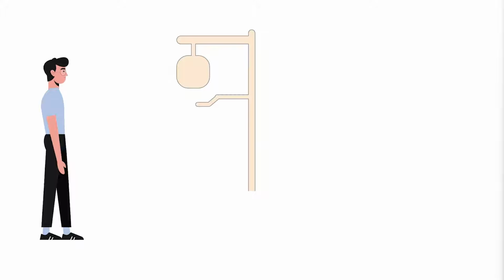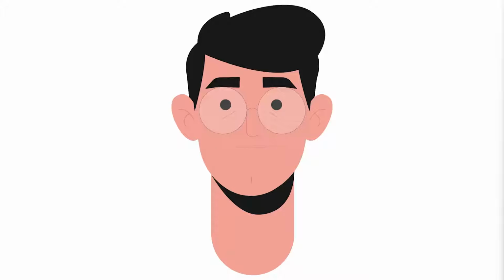Before we can position John in the panoramic unit, we have to do a few clinical examinations. Let's see if John has anything metallic that can be removed. This includes hearing aids, headphones, earrings, dentures, eyeglasses, necklaces, or non-metallic objects such as candy or chewing gum. If he has a mask with a metal nose clip pulled down on his neck, let's remove that mask too.